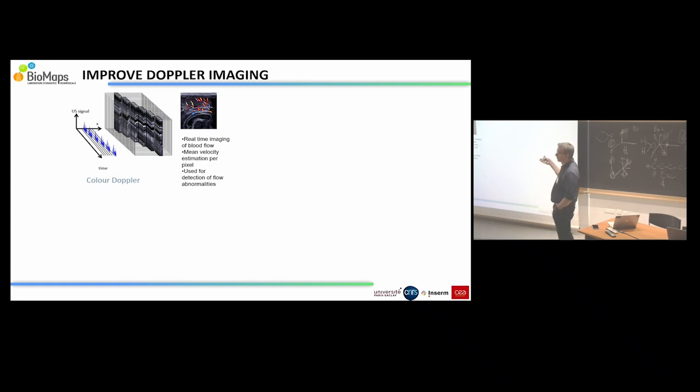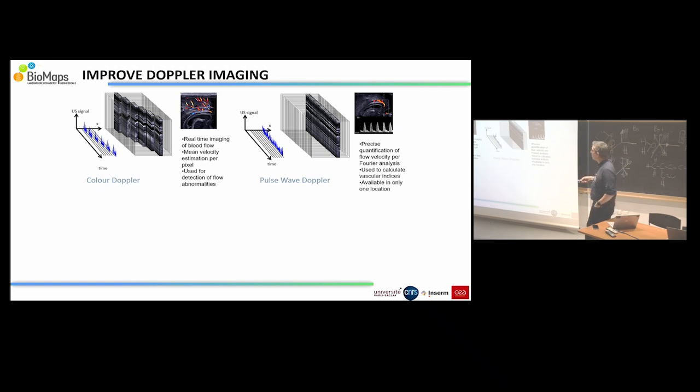We have the information about the blue flow, the red flow. And if we want to have a very high information about the change of velocity in one point, we will focus our ultrasound along one line in order to have a huge number of samples to get a beautiful sampling of the change of speed of the blood into vessels, but it will be only in one position.